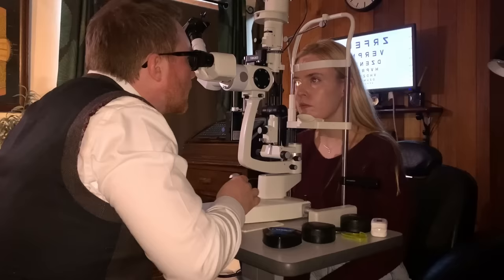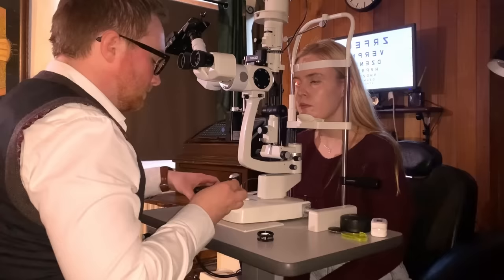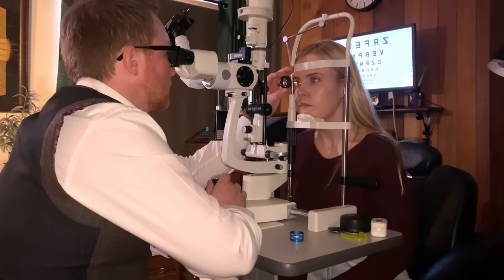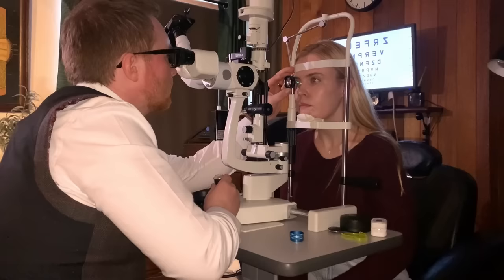And then I'm going to hold a lens up in front of your eyes. It's just going to give me a good detailed view of the back of your eyes. So looking past my ear for me. And then if it gets a bit bright, just let me know. And then looking straight up at the ceiling for me.